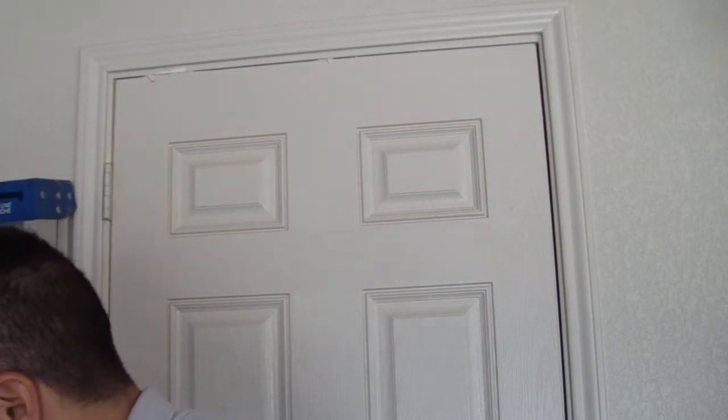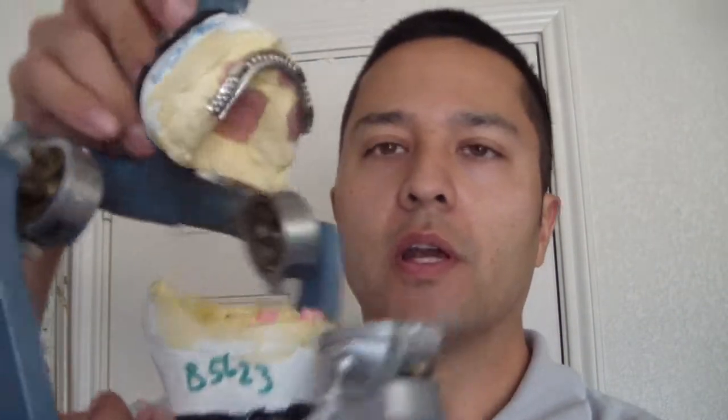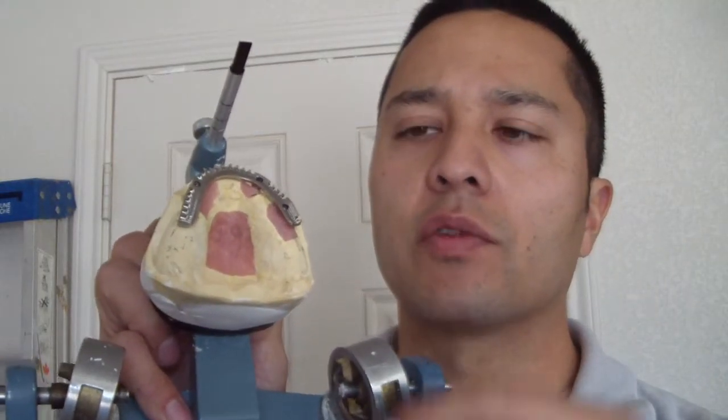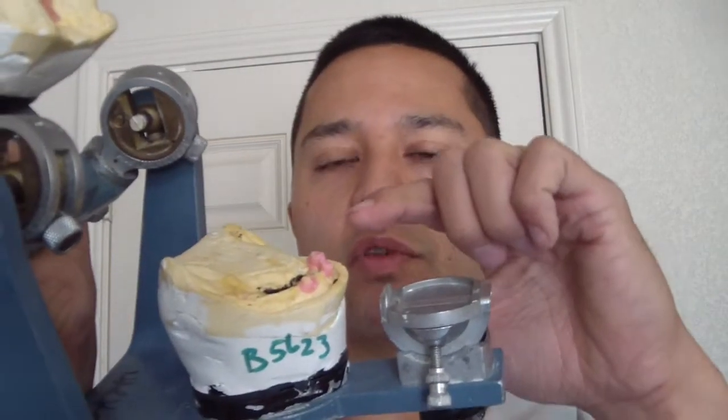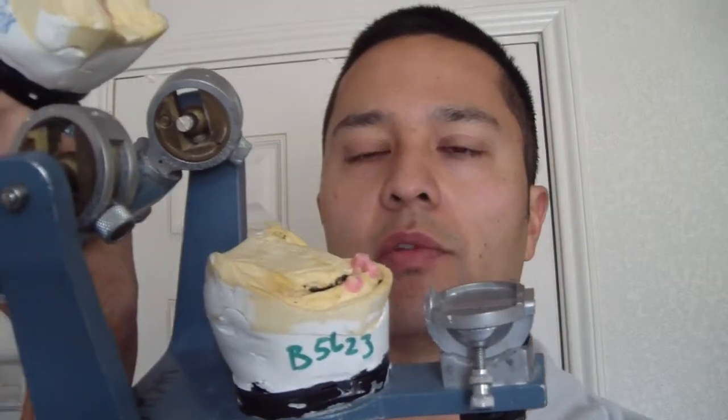So we have this bar that was fabricated, and here it is now put back onto the cast. What we're going to do is complete the wax-up, process the acrylic, and then have this fixed — screw it down — and this will be a fixed overdenture in the patient's oral cavity. We're going to continue with the locators on the mandibular arch.